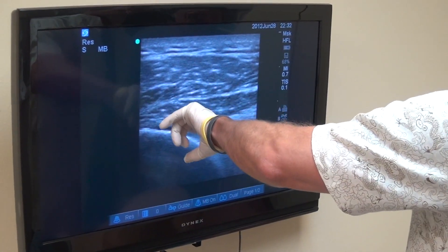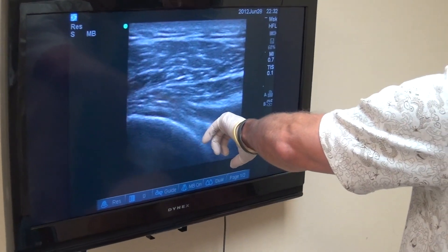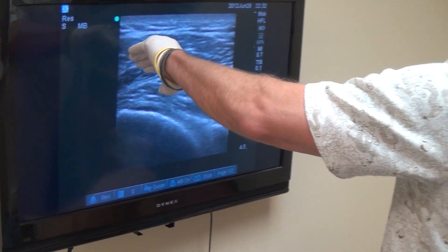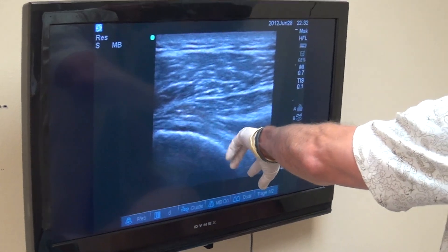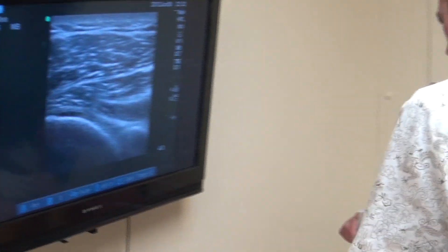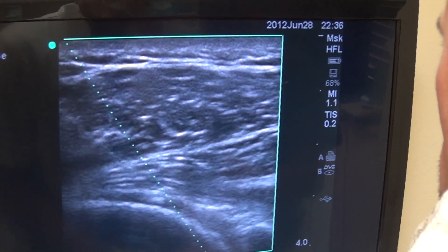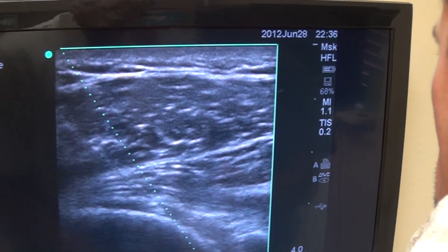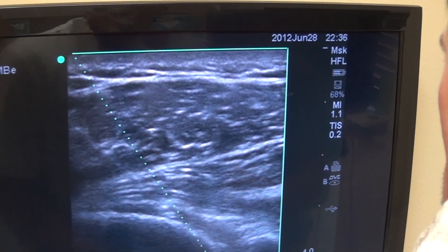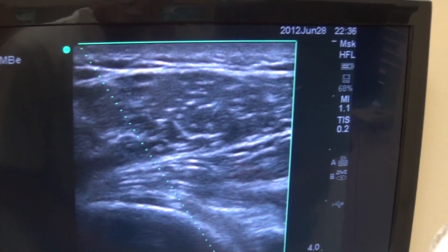This shoulder treatment is done under guided ultrasound. Here I'm directing Dr. Chen on our approach into the shoulder joint and also into the labrum as well as the capsule of the shoulder. Here you can see the needle — the needle tip is in the shoulder joint.